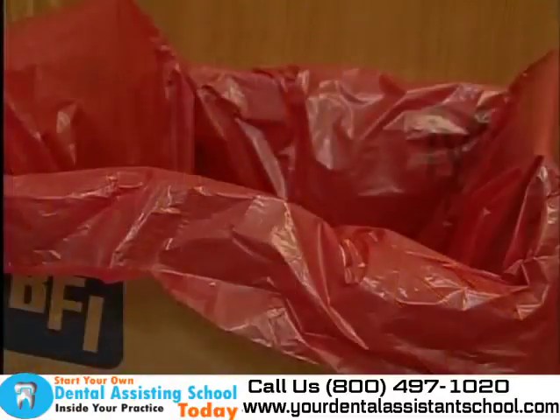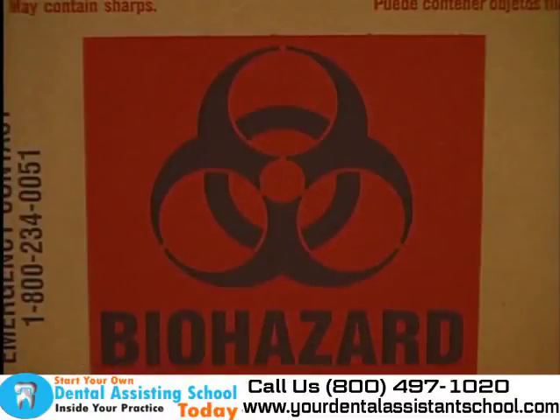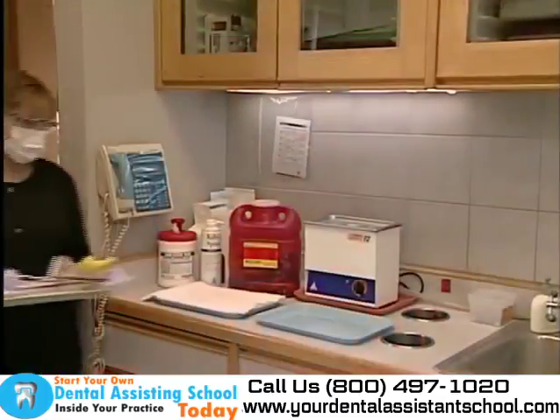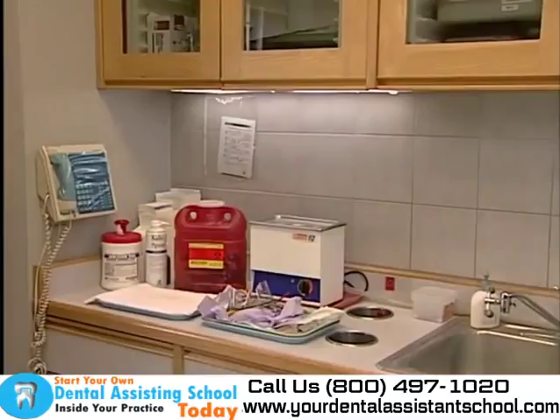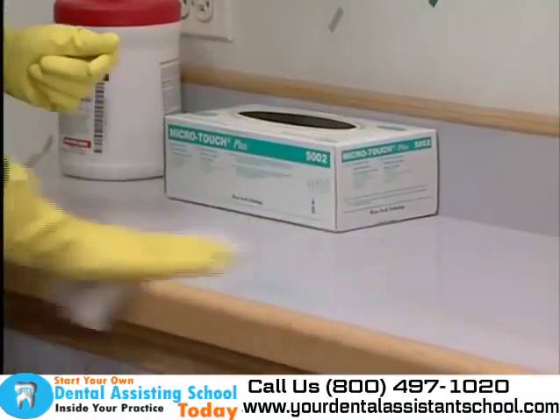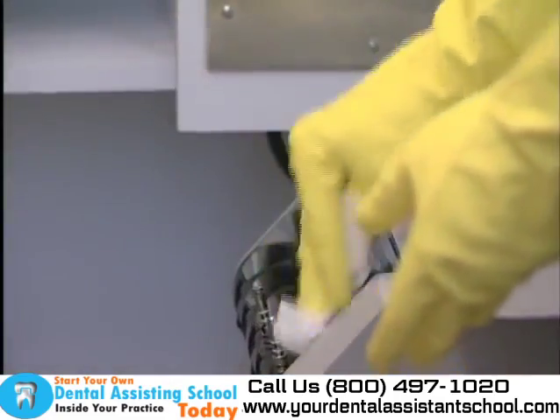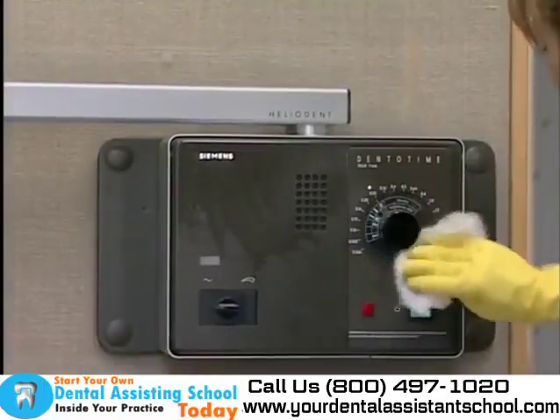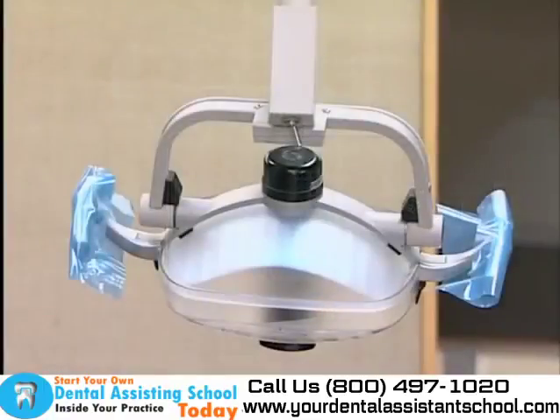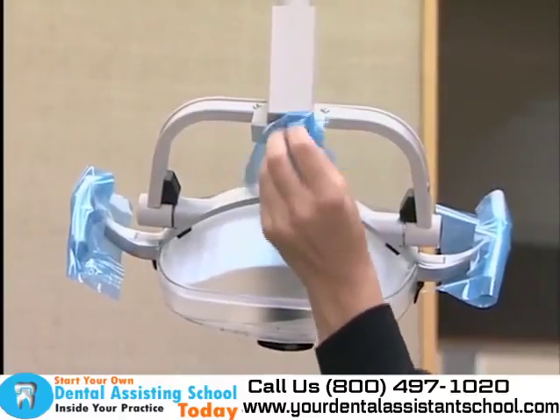Used cotton balls or gauze need to be disposed of in special biohazard containers. The assistant brings the instrument tray with the used instruments to a cleanup sterilization area. Countertops and other uncovered environmental work surfaces are disinfected, as well as any area of the room that was contaminated by spatter. New plastic barriers will be replaced before the next patient.